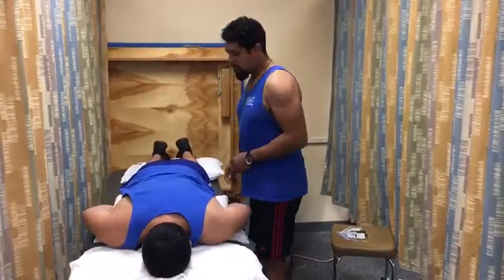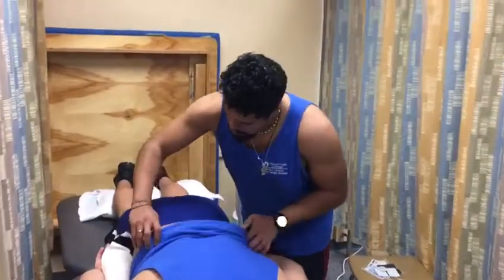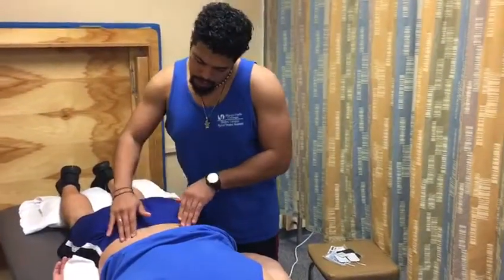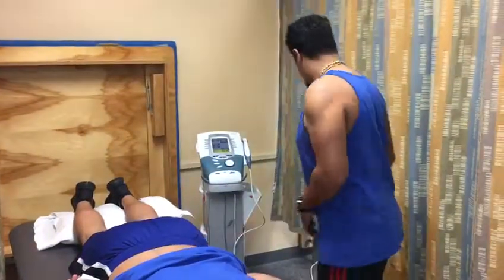Okay, comfortable there? Mm-hmm. Very good. I'm going to be lifting up your shirt. Is that okay? Mm-hmm. Very good. All right, first you assess the skin. All right, feel my fingers. Mm-hmm. Very good. Then you clean the skin.